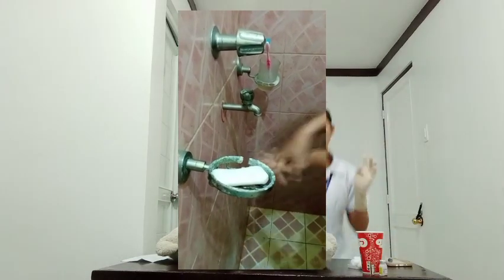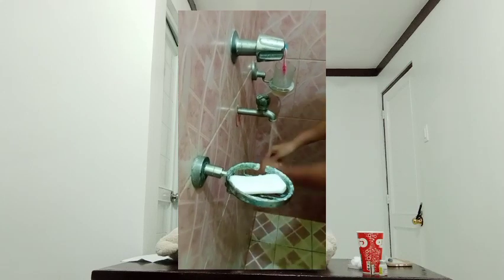I'm back, and as you can see, I already put on my gloves. Now, we will provide for client privacy to provide comfort. So, again, close the doors and the curtains. We need to prepare the client prior to performing the procedure. We need to introduce self and verify the client's identity using the agency protocol to enhance rapport and ensure that care is being rendered to the correct patient.